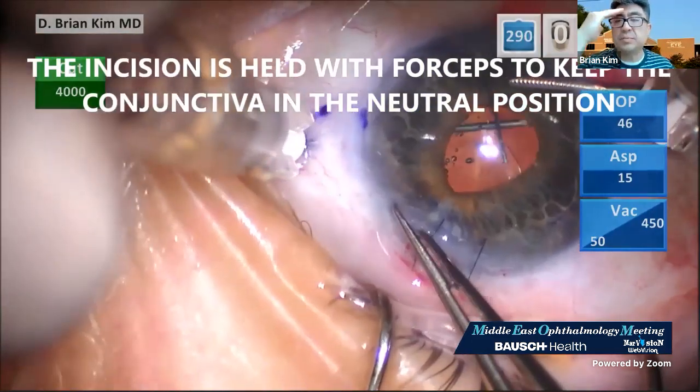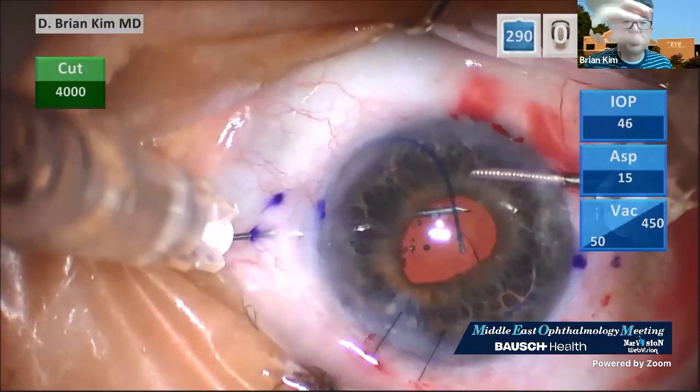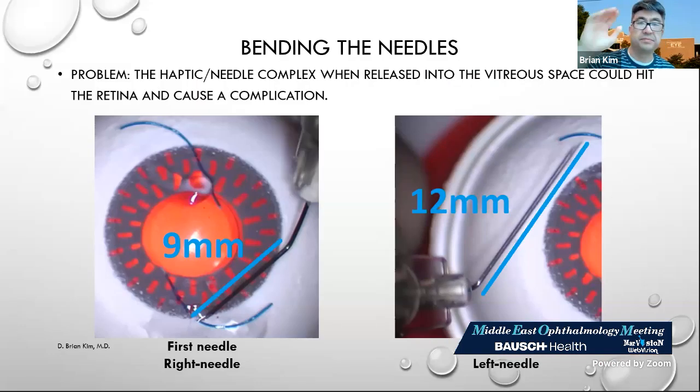And so this is very important because if you're moving the globe around and you're trying to make the needle pass, you will not be placing it where the marks are. And so naturally, you're going to have a higher risk for tilt or decentration. And so bending the haptic.